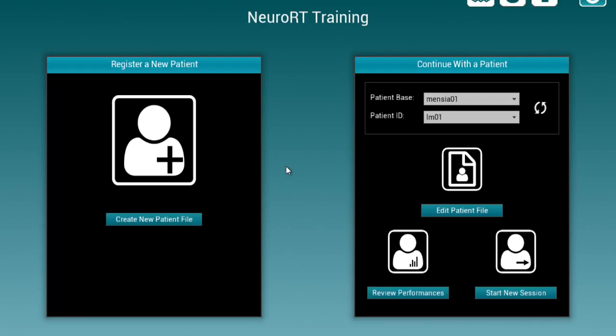Welcome to Neuro-RT Training. This video is going to give you a brief walkthrough of Neuro-RT training capacities. This software has been designed for neurofeedback practitioners.